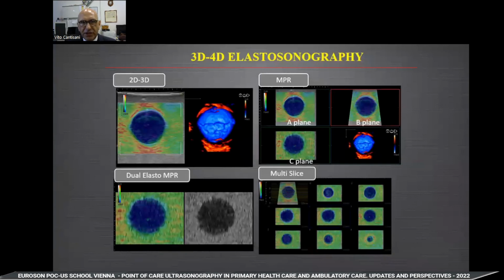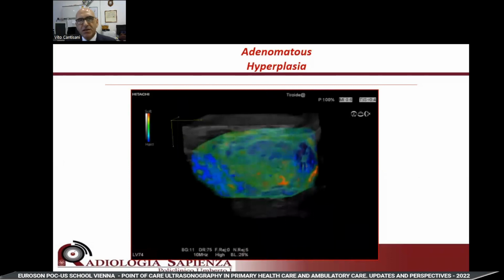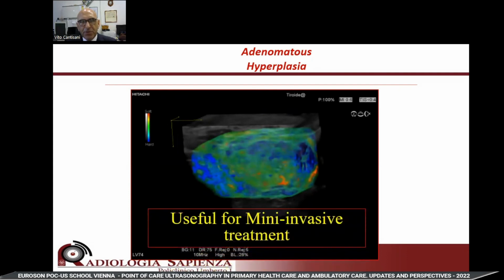3D, 4D, in real time. Now, the vendors are trying to provide us the possibility of a volumetric acquisition. And I showed in some of my papers, this one published in the International Journal of Endocrinology, that it can be used especially for guiding and for evaluating minimally-invasive treatment.